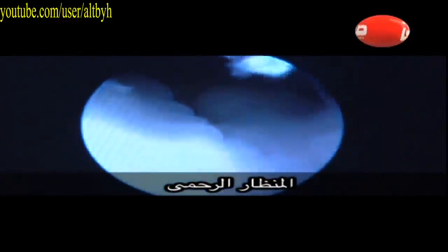You can see here the hyperplastic endometrium in this postmenopausal patient. And it's also an important practice to have a look on the other part systematically on the uterus, as you can see.